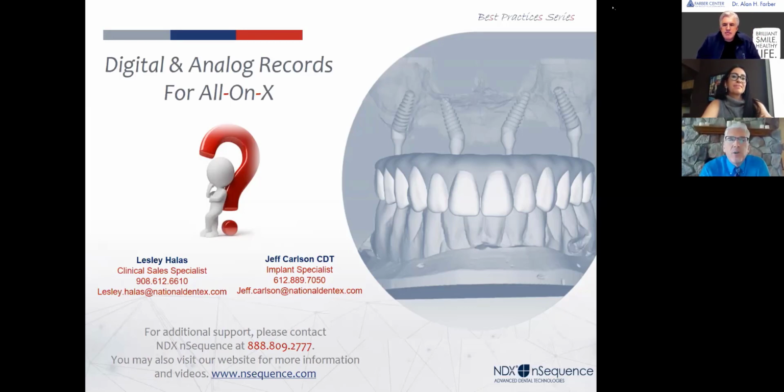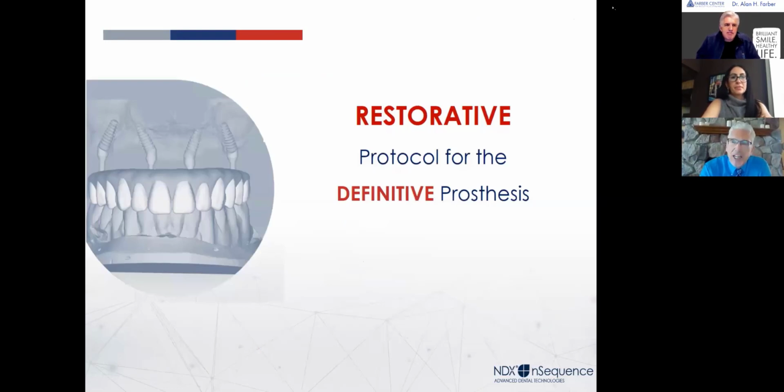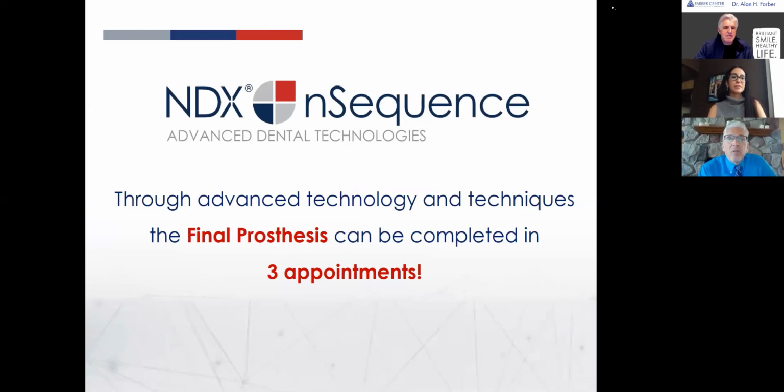Okay, well, we're going to get on to the next step, which we're going to talk about. And this is a good topic, because with the definitive prosthesis, the finals, the patient's going to come out with a very nice long-term provisional. It looks very nice, and we've got metal reinforcement in them. Patients are usually quite happy with that. But we still got to look at, we're going to come into the finals. What are we going to give this patient now as the final?